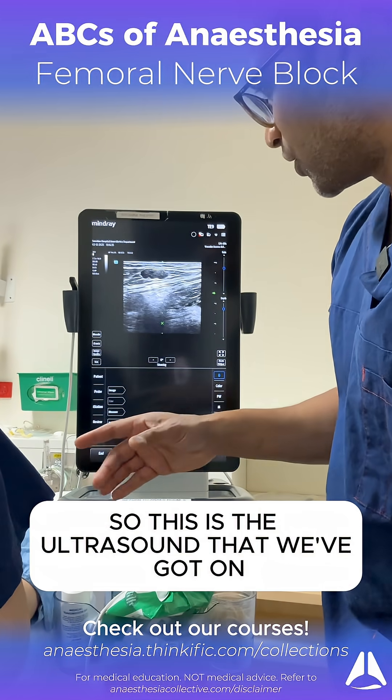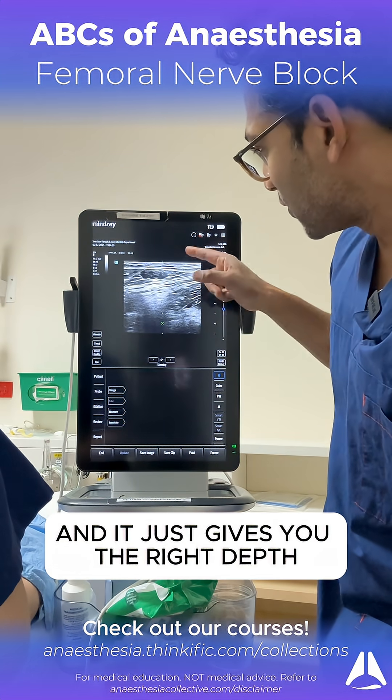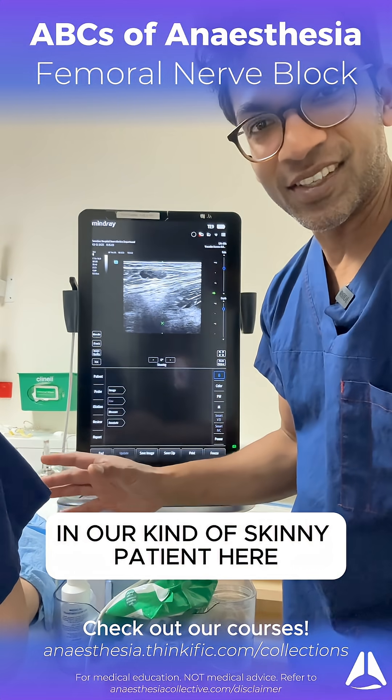So this is the ultrasound that we've got on. It's just a linear probe, it's around 12 megahertz, and it just gives you the right depth. So we're roughly at around three centimeters in our kind of skinny patient here.